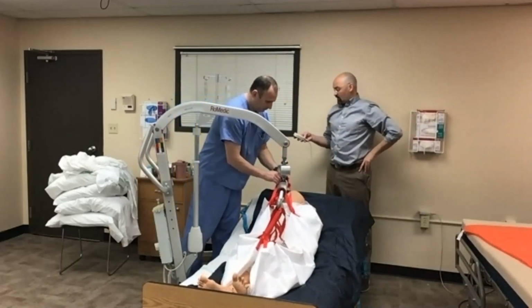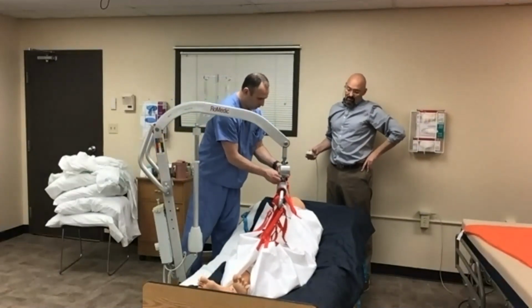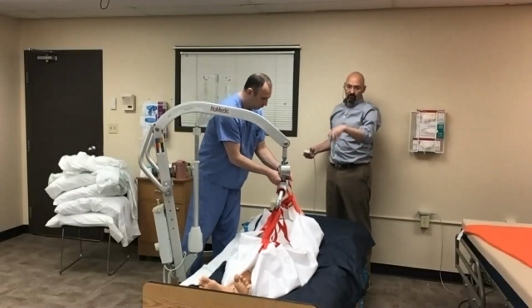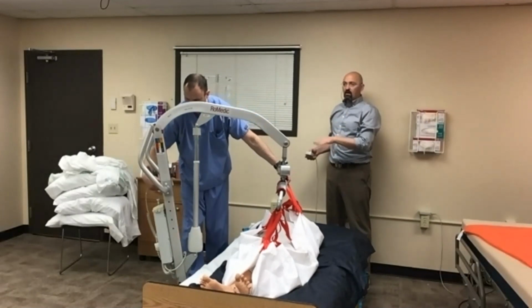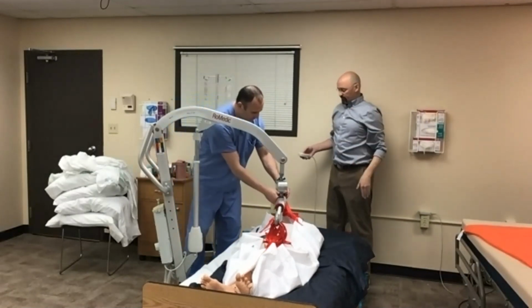As you can also tell, we have this at the lowest level. The reason we've got this at the lowest level is because of the height of our floor lift. We want to make sure we get enough height to be able to turn that patient all the way to the prone position.